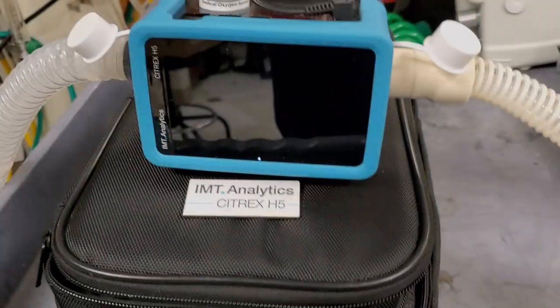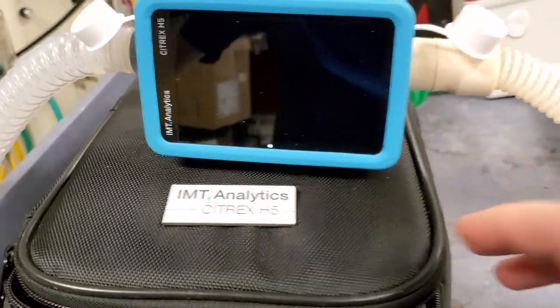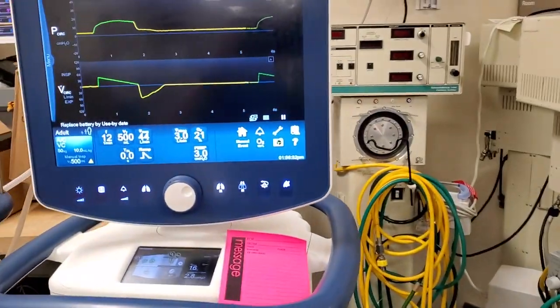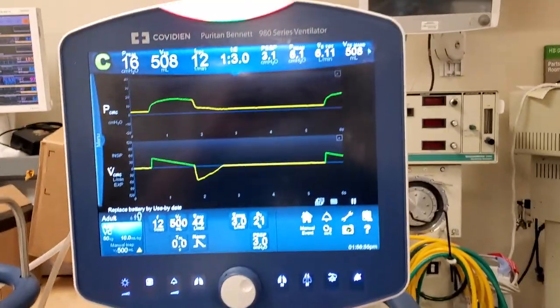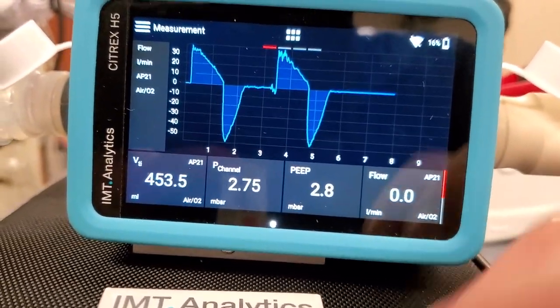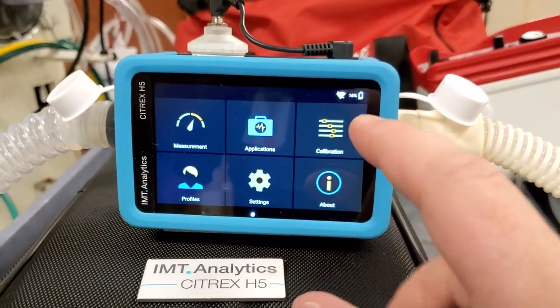I've been playing around with the IMT Analytics Citrix H5 and it's quite the analyzer with a lot of functionality. Here's the device — look how tiny it is, sitting on its own carry bag. It comes in a very neat kit and also has a test lung inside it. I have it hooked up to a Covidia 980 and it's running. There's a main menu up here at the top, very similar to what you'd find on an Android tablet — I do believe it's running Android.